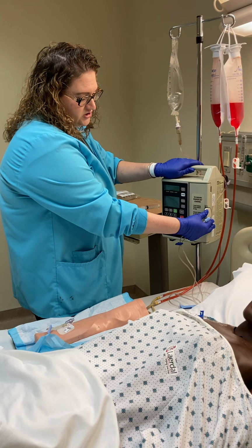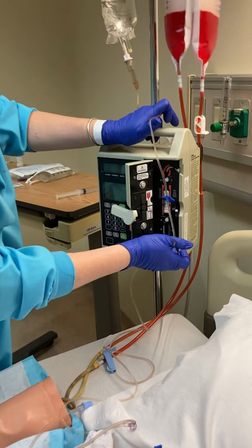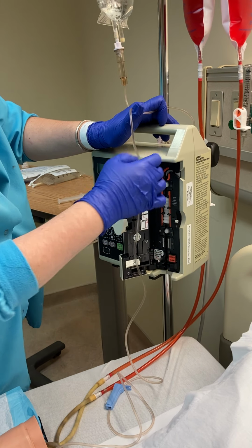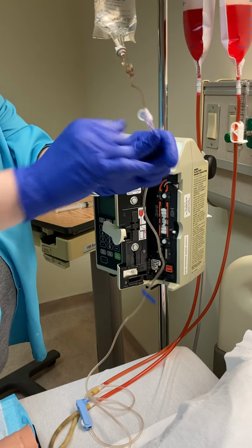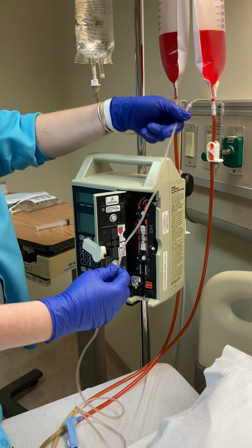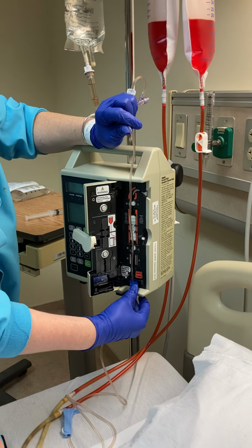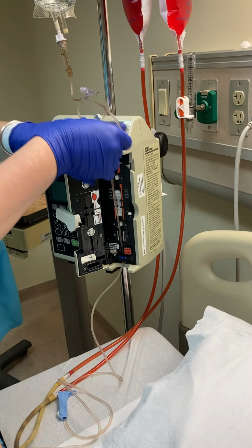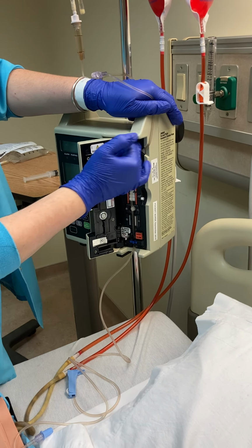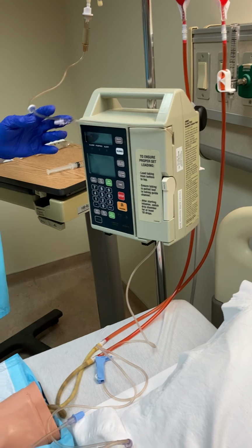But for this one, we're going to push this lever and open. And then we're going to feed. So I have to make sure that this little safety clamp is pressed down so that I can weave my tubing through. This top port is going to be for your piggybacks, so it always has to be above the pump. So I'm going to start down here, and insert my blue clip right below where it says safety clamp. I'm going to weave this up and around, and then I can close my door and push it shut.